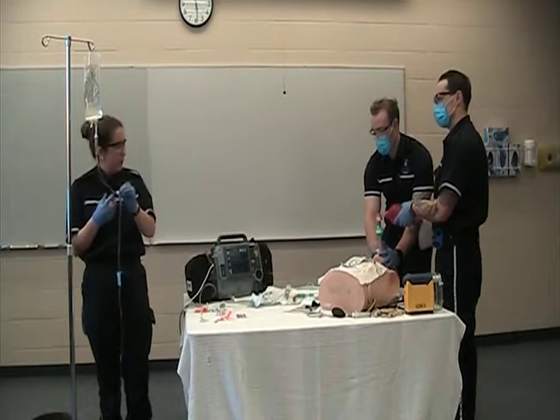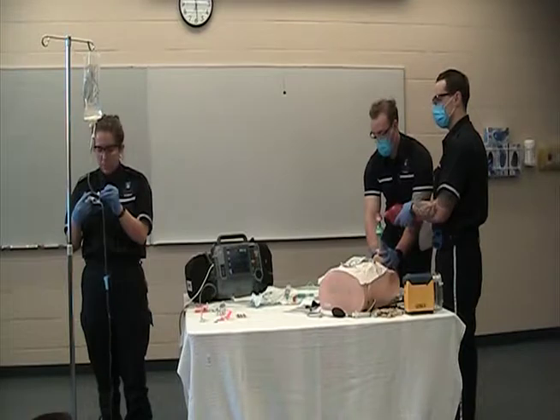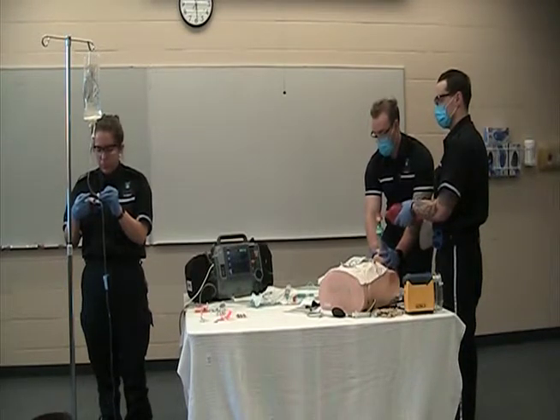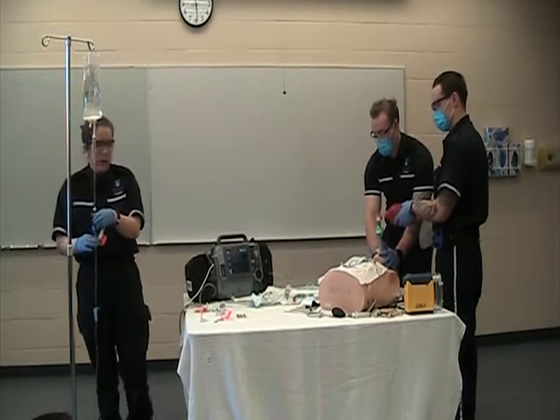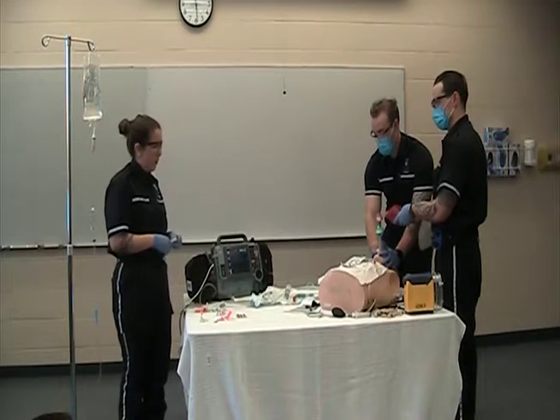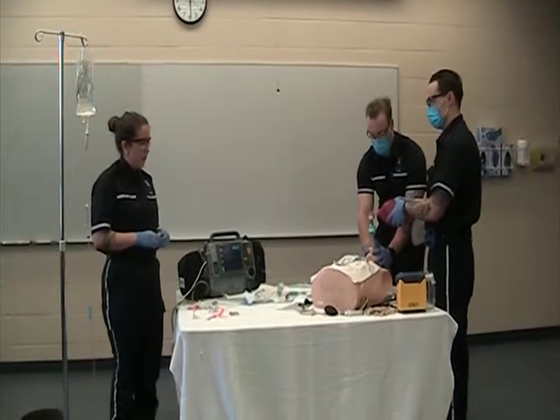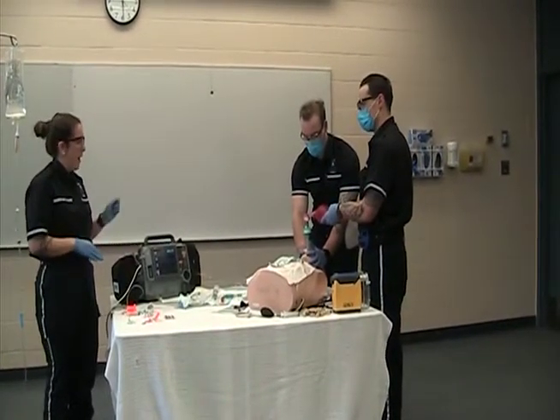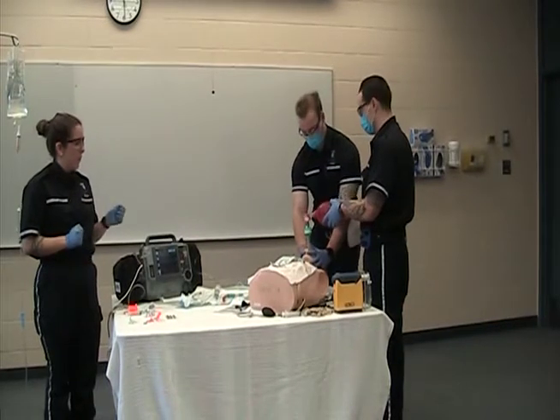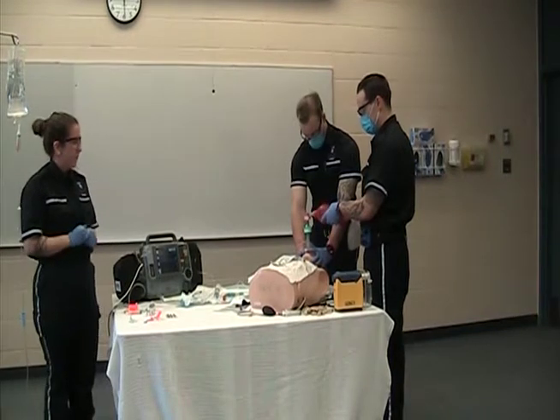So we're good to go with sux. I'm going to start pushing that now. Okay. So again, looking to my patient for signs of fasciculations. And it does, like I said, take 60 to 90 seconds. So now we're going to start seeing some at the feet, some at the abdomen, and I'll have Jevin looking to see when the fasciculations are complete at the head is when we can start our intubation.